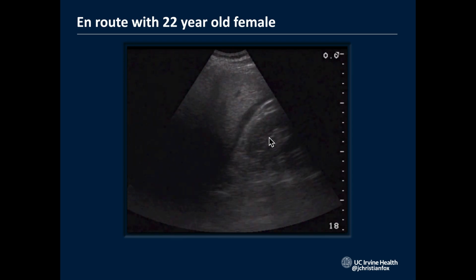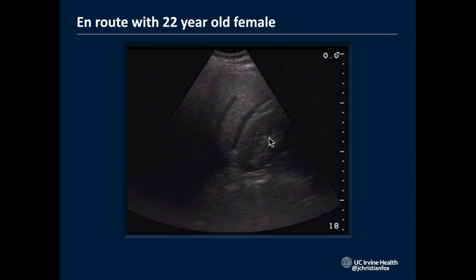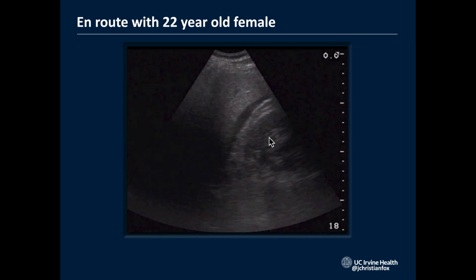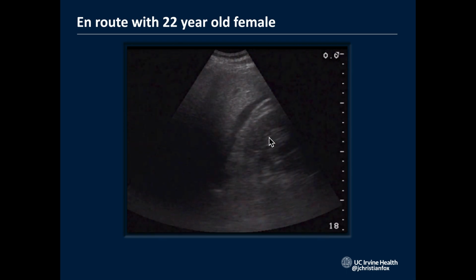And in the setting of a coding patient with a positive FAST exam, we went ahead and started to cut the rest of the clothes off this patient. But she didn't have any other bruising or contusions or signs of trauma. And okay, so now we're like, why would a 22-year-old female have a positive FAST exam? She'd be coding, yet no signs of, oh wait, maybe she has an ectopic pregnancy.